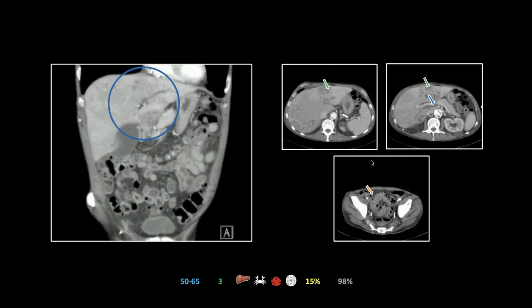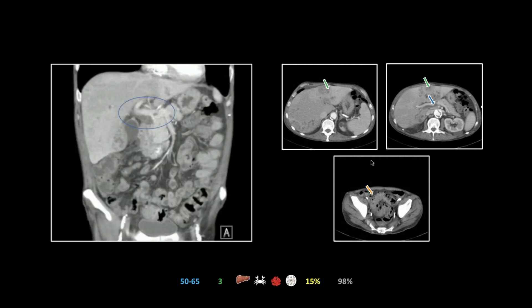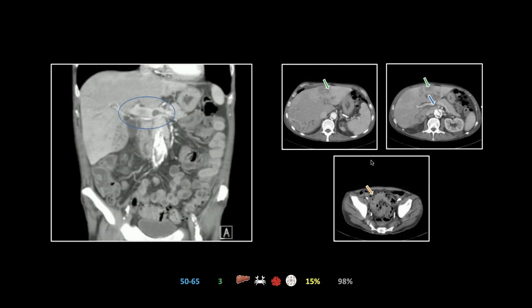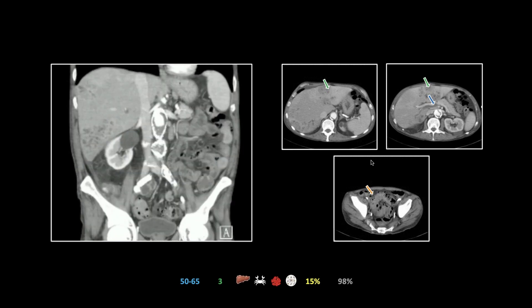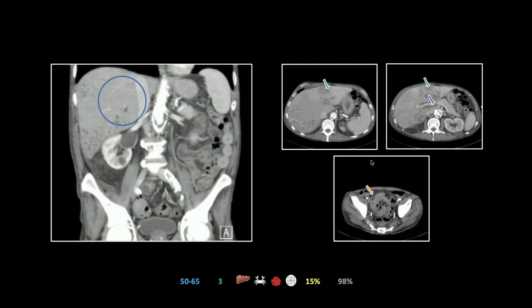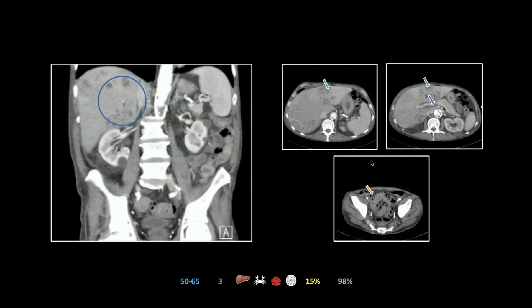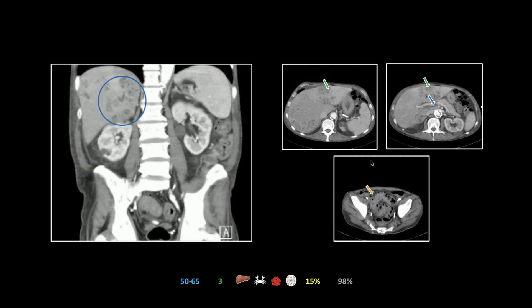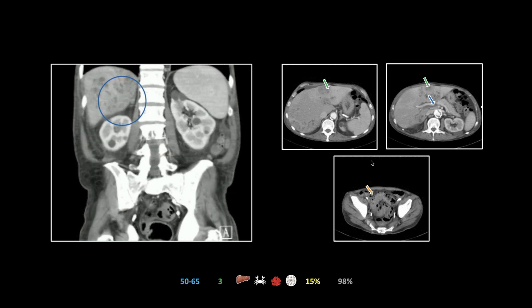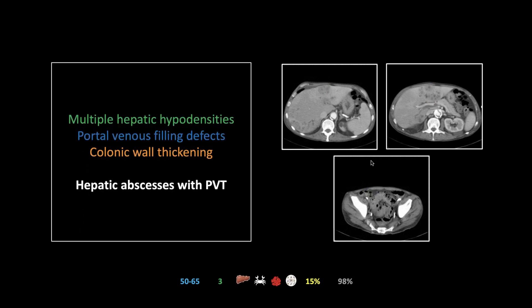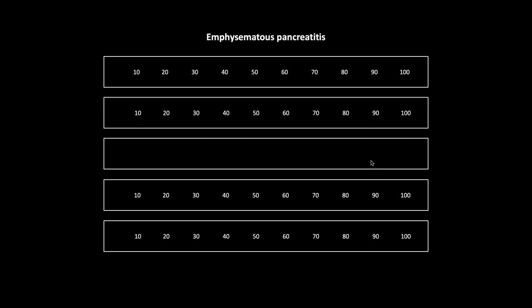On the coronal, you can really appreciate the venous thrombosis — you can track the portal vein thrombosis into basically every segment of the liver. Very extensive. That is the case of hepatic abscesses with portal venous thrombosis.